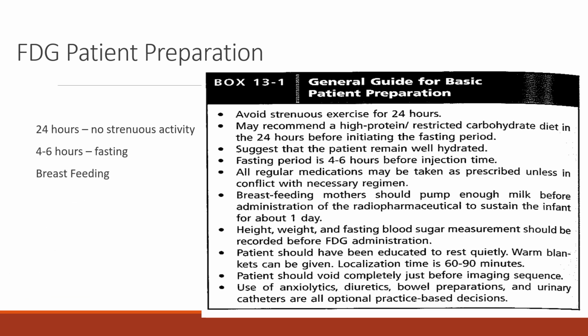So a couple of very important things because they will affect the quality of the scan. No strenuous activity for 24 hours, fast for 4 to 6 hours, and then no breastfeeding, or if you are breastfeeding, pump and dump for a day.